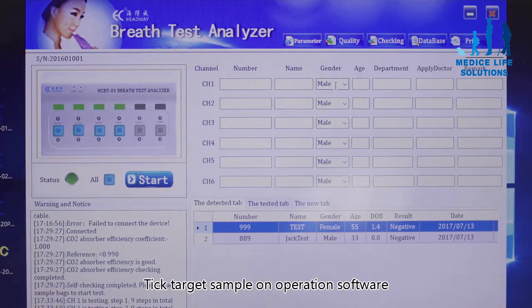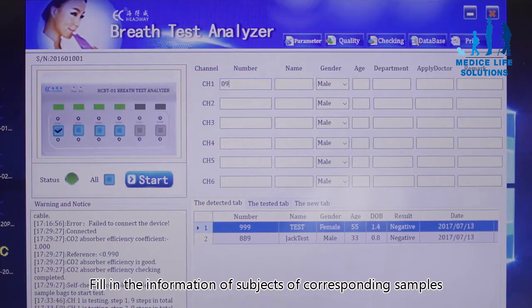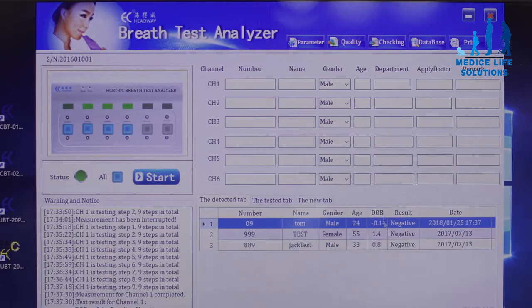Tick the target sample on the operation software. When a port is selected, the select box will show a tick. Fill in the information of the subjects for corresponding samples. Click the start button to test the selected samples in turn. Test results will be automatically saved when the test completes. Print the test reports.